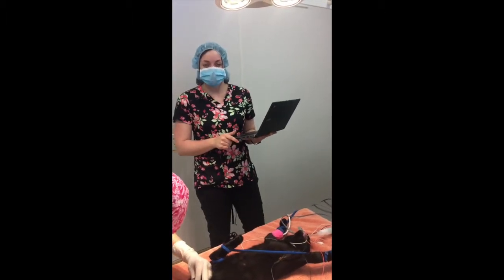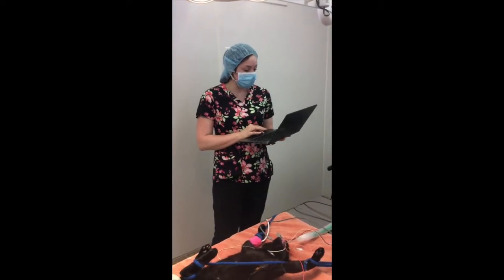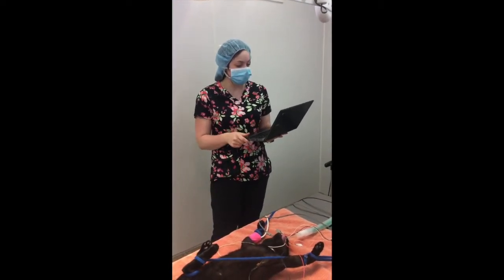Alright, this is Loki. He is a feline neuter for today. I'm going to be taking some anesthetic monitoring readings.